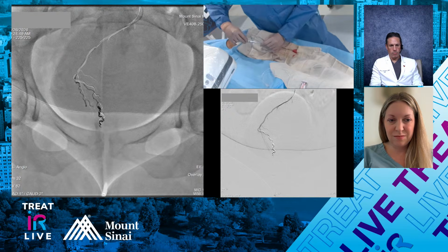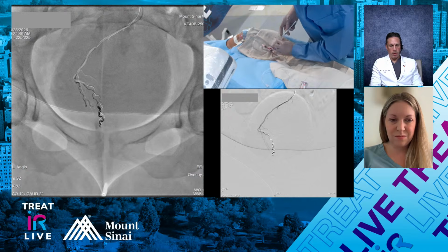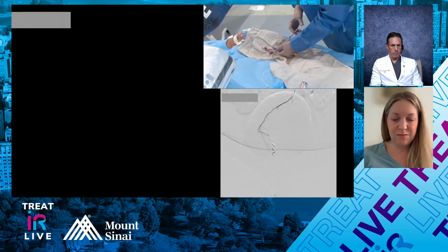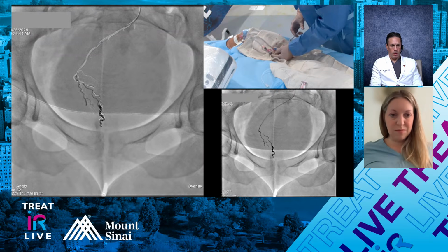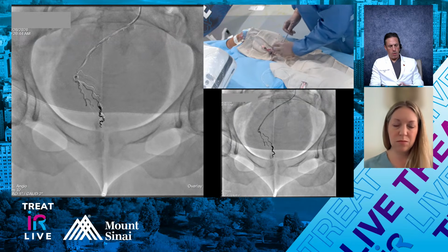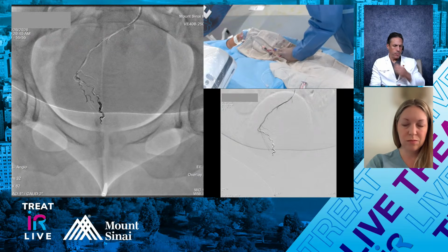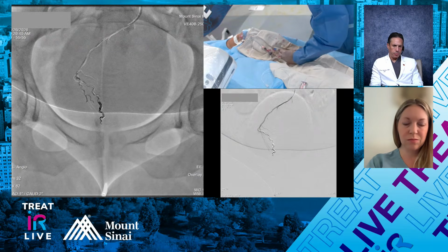The image quality here is beautiful. There's no question about it. We really have no issues in terms of seeing what we need to do, and I'm rarely increasing the dose the way I would with other commercial vendors. I just don't have to do it. You can talk about your prostate experience because, like I said, that's one of the hardest on a machine. I think a prostate is really an important test for a machine.